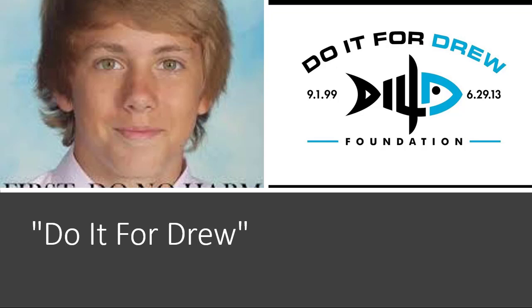They didn't have end-tidal CO2 on. If they put end-tidal CO2 on immediately, because they intubated at 11:21, if they put it on at 11:22, they would have noticed immediately that his tube was not in place. They would have pulled it. They would have either re-intubated, used a rescue airway, or gone back to bagging because they were successful at bagging.